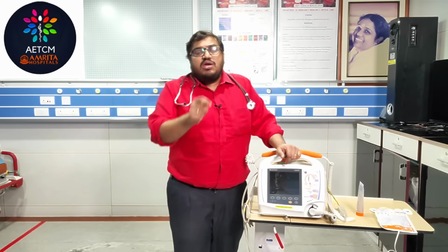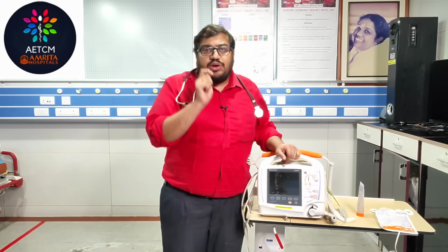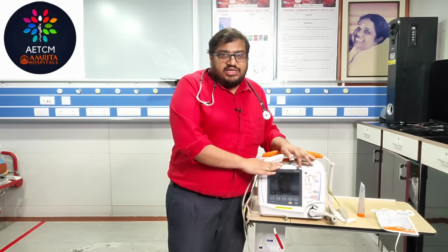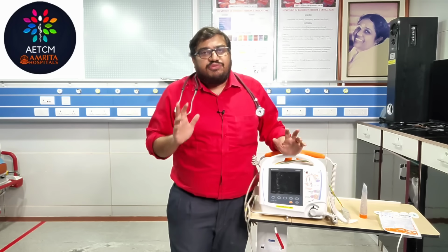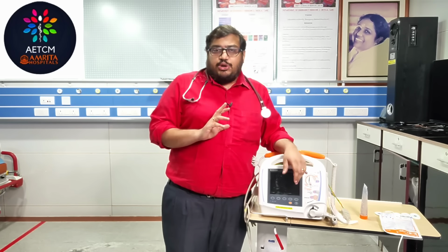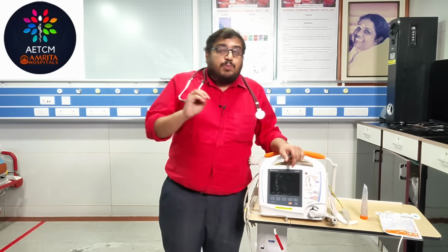So it's very important that when you are going for a cardioversion, always remember to do it as a synchronized cardioversion. I will show you the device and synchronized cardioversion. So this is basically the difference between defibrillation and cardioversion, and the mechanism is the same, everything is the same. Now we will see the procedure in detail.